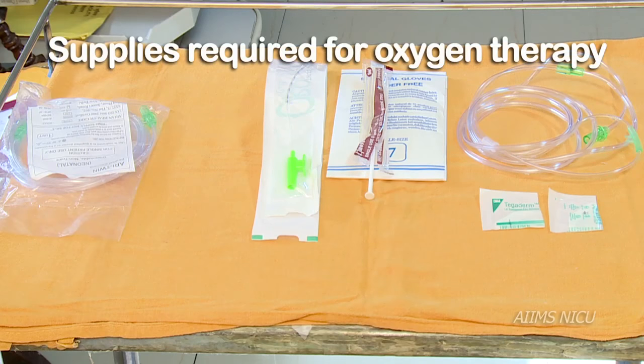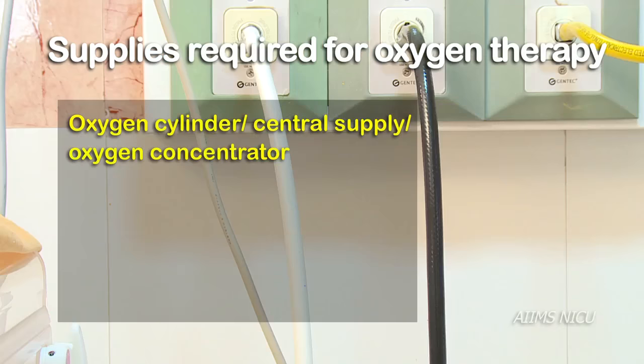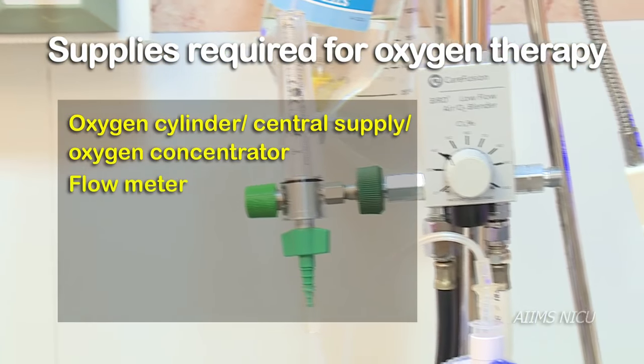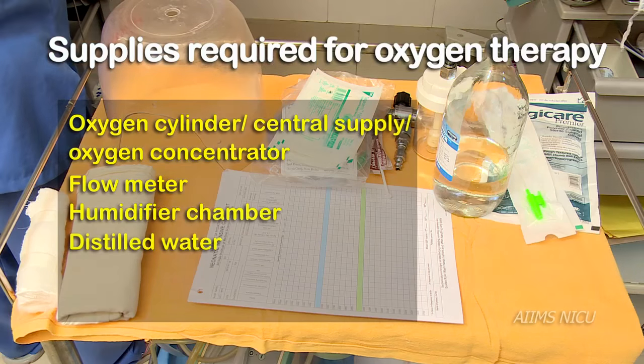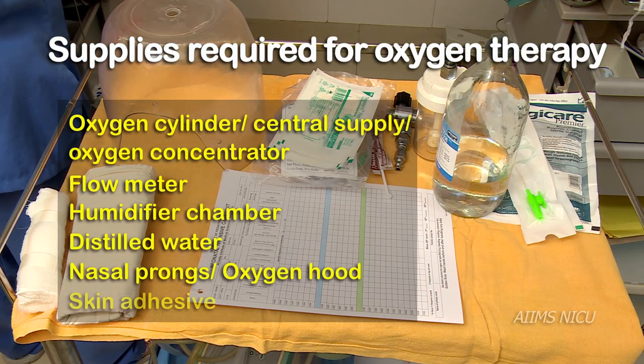One should ensure the following supplies before starting oxygen therapy: a source of oxygen in the form of a cylinder, central supply, or an oxygen concentrator; a flow meter; a humidifier chamber; distilled water; nasal prongs of appropriate size or oxygen hood; and skin adhesive to fix the nasal prong.